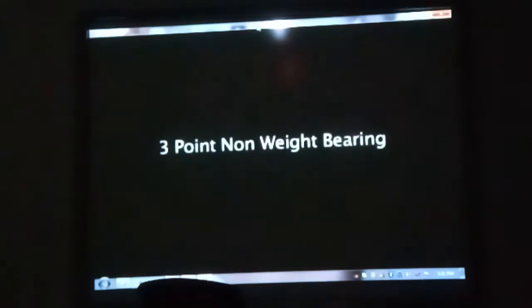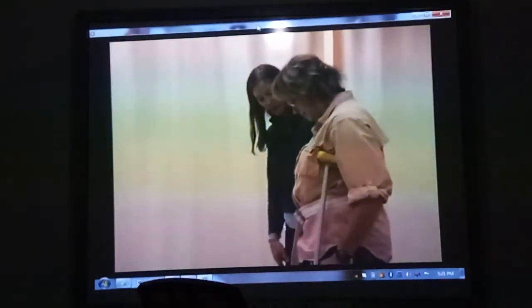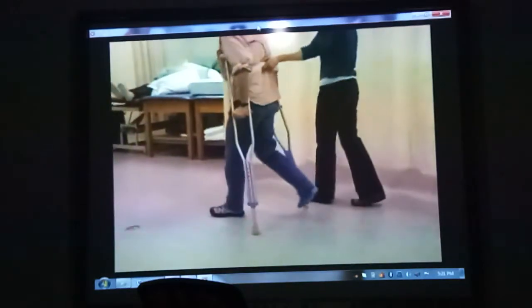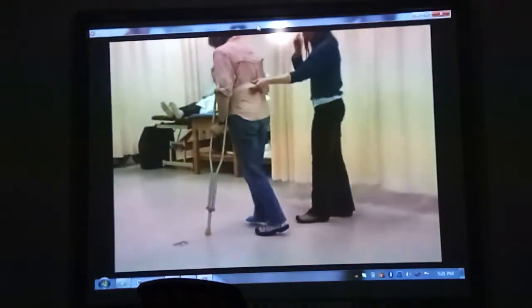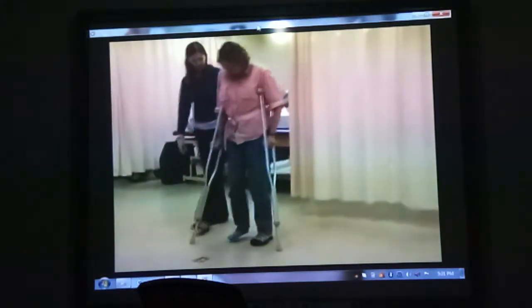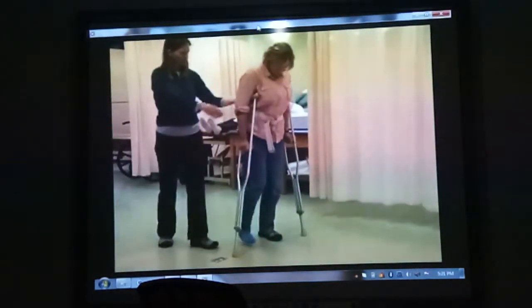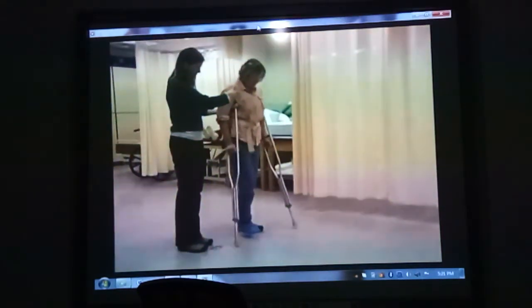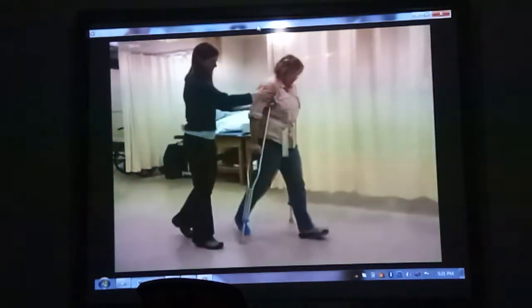3-point. So remember with the crutches first, the surgery leg, and then swing through. Good. 3-point. Nice job. Okay, why don't you take little steps as you're turning. I'll go this way towards your left. And I'll put my hand up here just in case to keep you safe. All right, crutches first. Leg, and swing through.